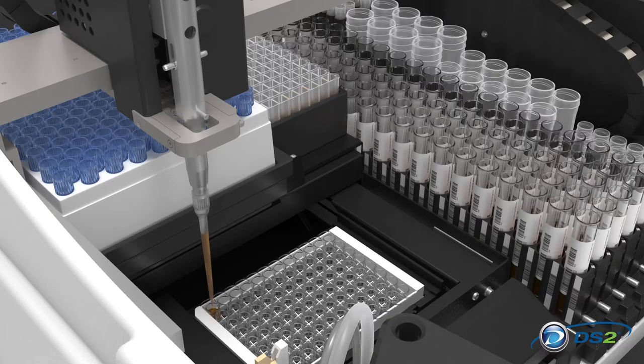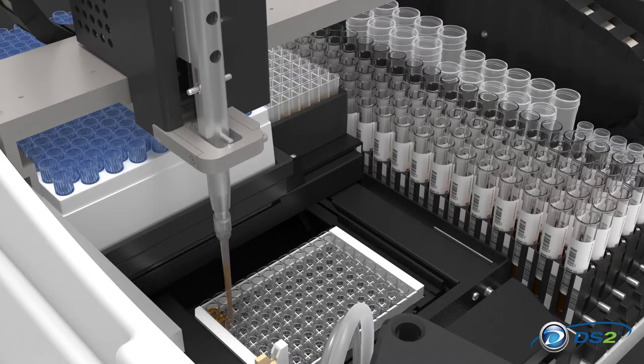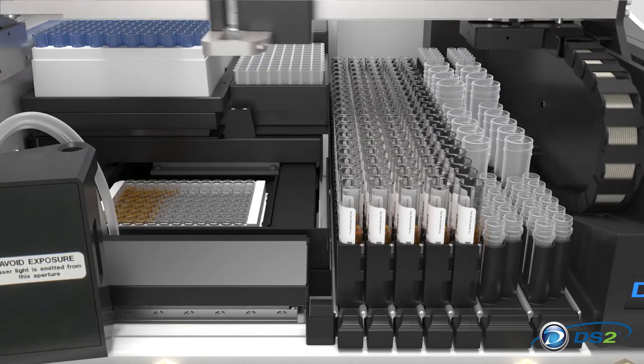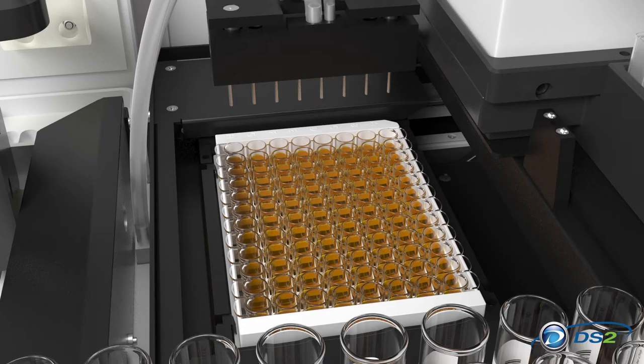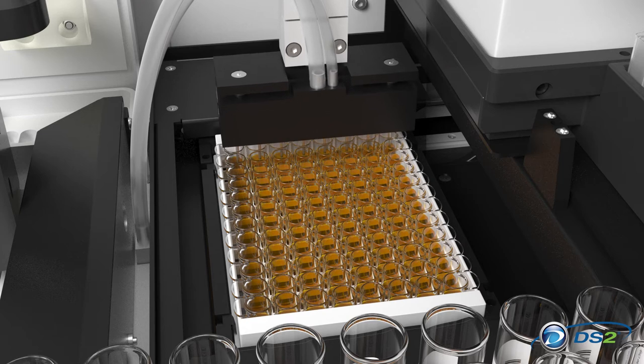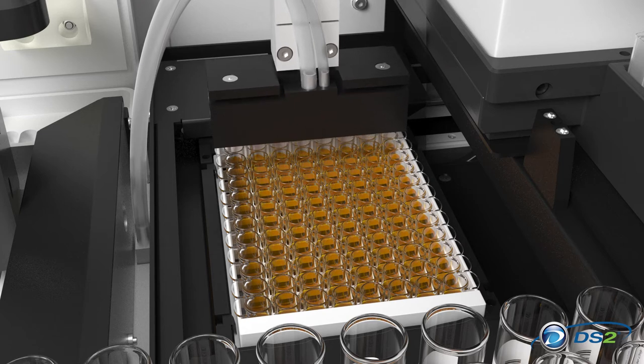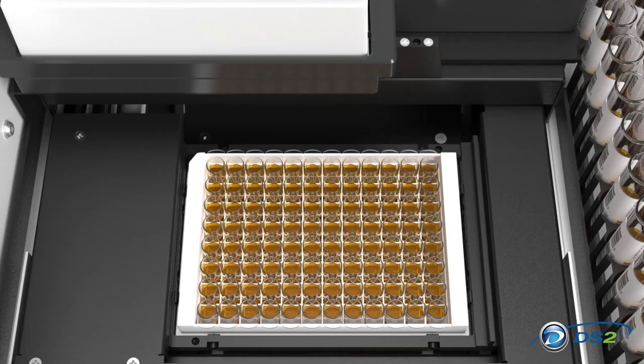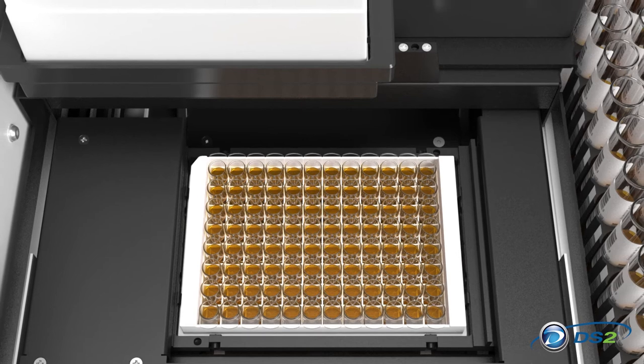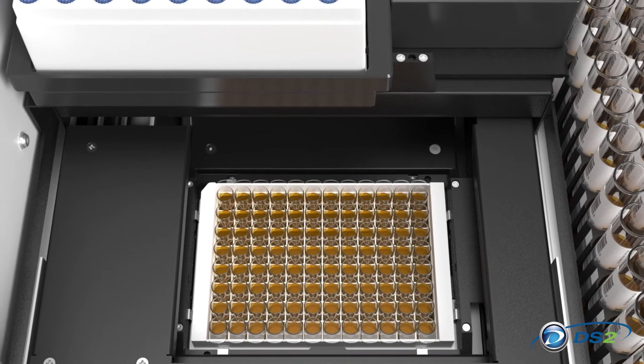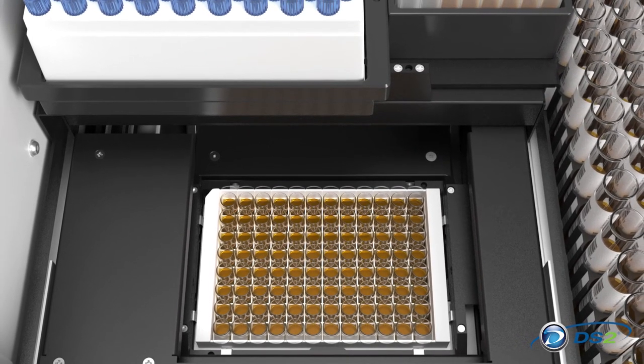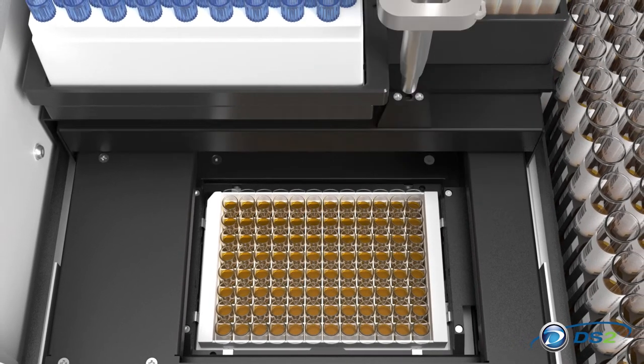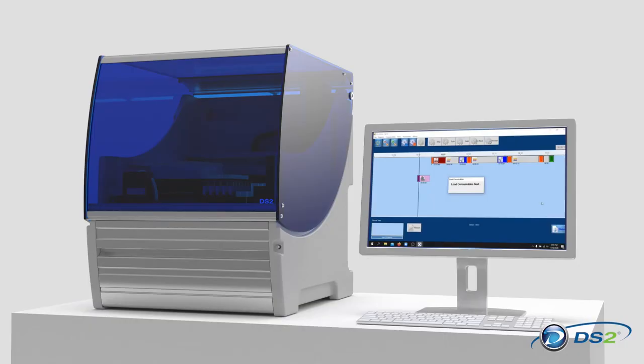The pipette module performs all pipetting and dispensing functions using disposable tips. Wash cycle operations are carried out by the wash module in conjunction with the robot arm. The two-plate incubation and reading module closes automatically to maintain a consistent temperature with a shake function available during reading.